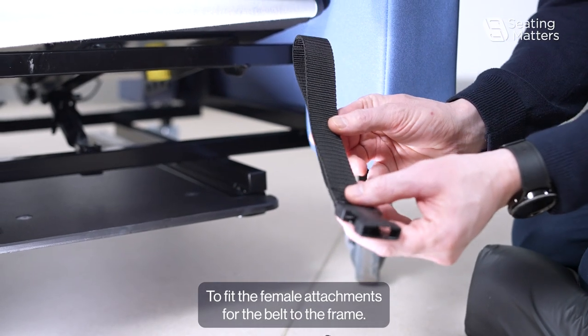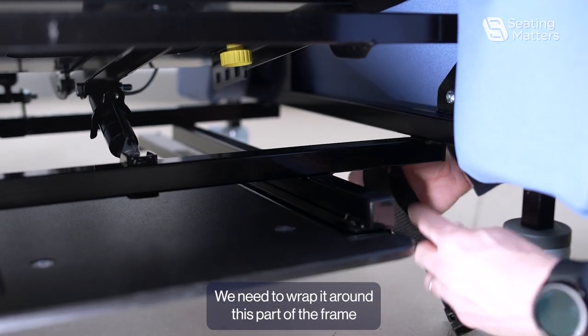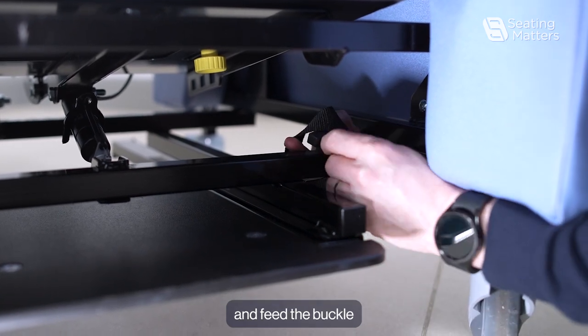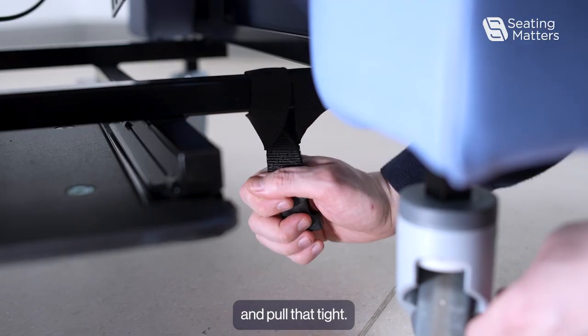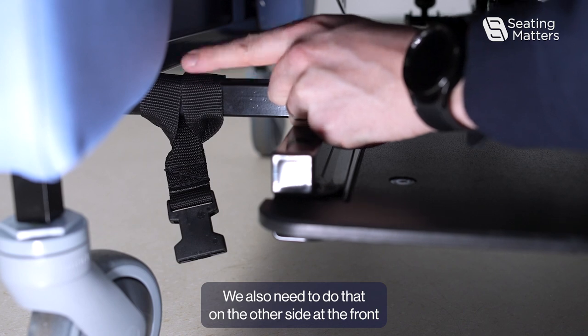To fit the female attachments for the belt to the frame, we need to wrap it around this part of the frame and feed the buckle through the lip and pull that tight. We also need to do that on the other side at the front.